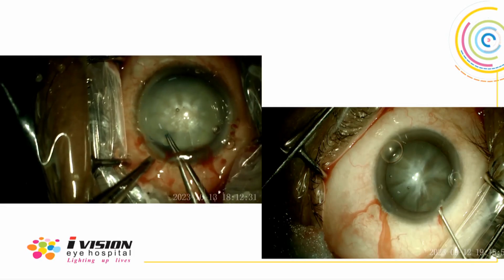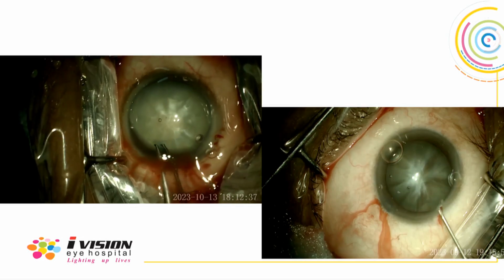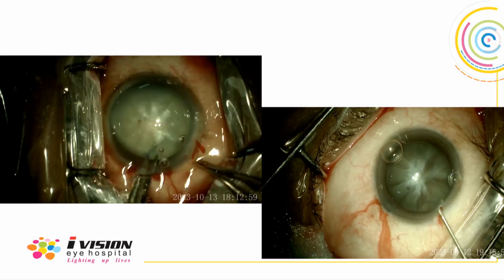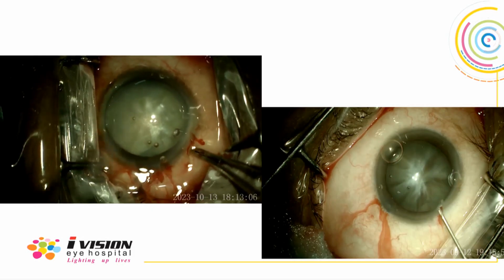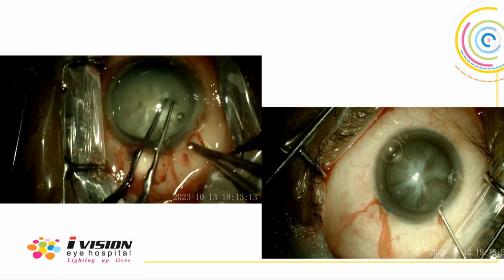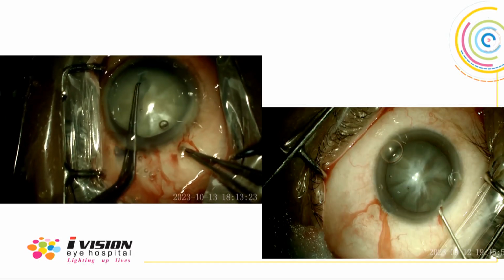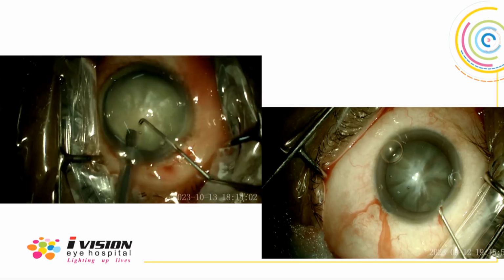Here I thought I had finished the rhexis. It was in the last step, and this is the place where it extends, at the section where your chamber shallows. It has run off, and I am cutting it with the Vannas. As this was a soft mature cataract, and I got a very large rhexis done, and my rhexis extension was near the section, I proceeded with the phaco. If the extension was on the opposite side, I would not have attempted that.